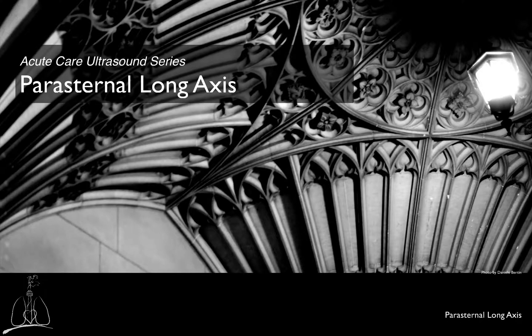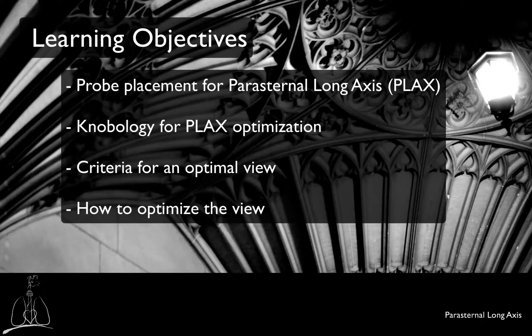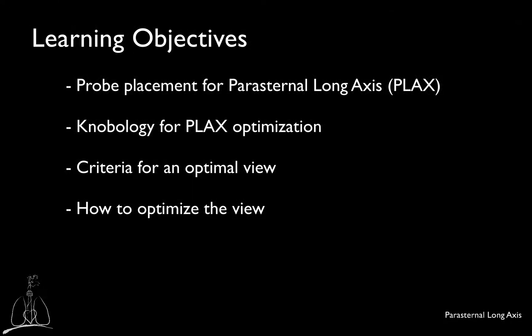The purpose of these videos is to standardize the performance of transthoracic echocardiographic studies and to help the learner optimize and troubleshoot image acquisition. This video will demonstrate how to obtain a parasternal long axis view. We will not perform any measurements at this time or use color Doppler. The second part of the video will provide tips on how to optimize the view.